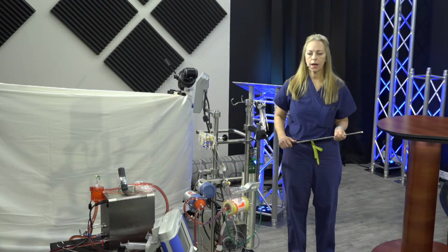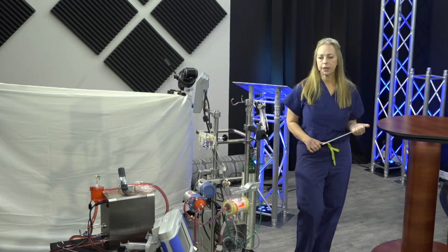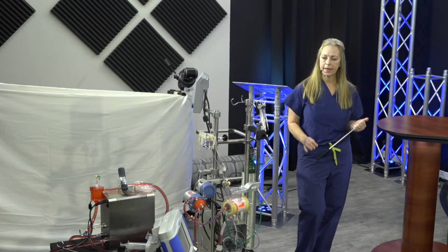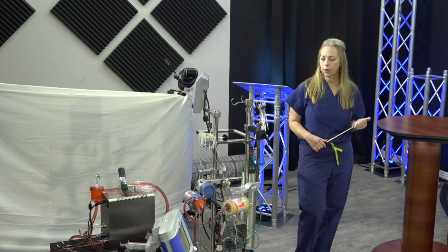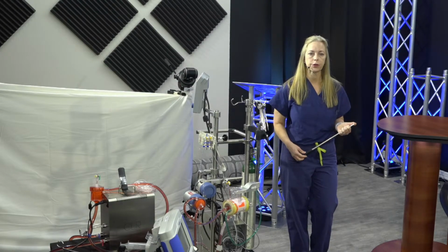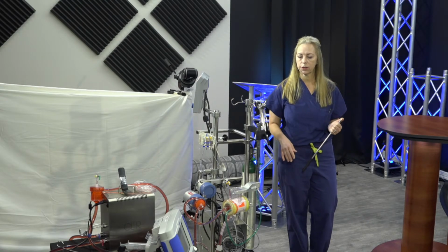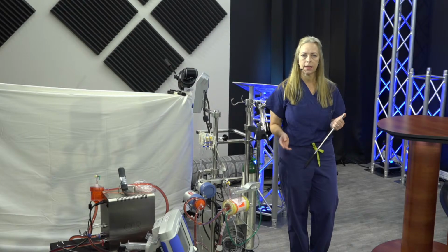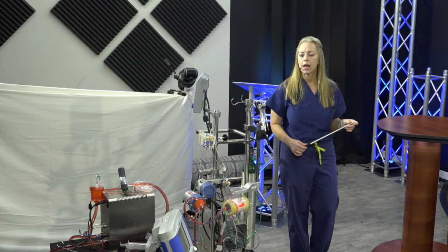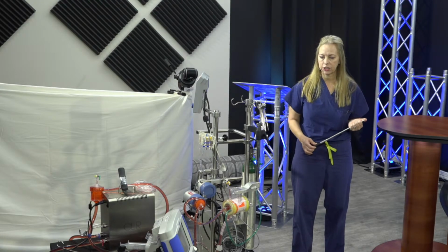Some things that we could talk about on the ELSA. So Joe talked a little bit about this device, and it has flow probes that look very similar to what you might be used to seeing on your ECMO circuit, on your bypass circuit, but they have an inlet and an outlet. So you have an access flow probe, so you know exactly what's coming out of the patient, and then you have a return, so you know exactly what's going into the patient.